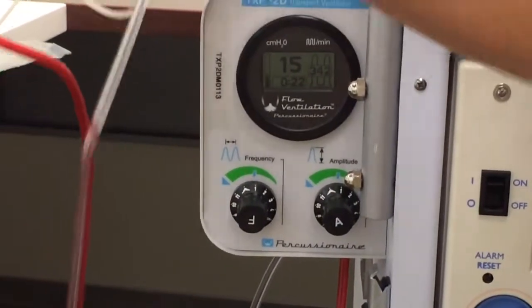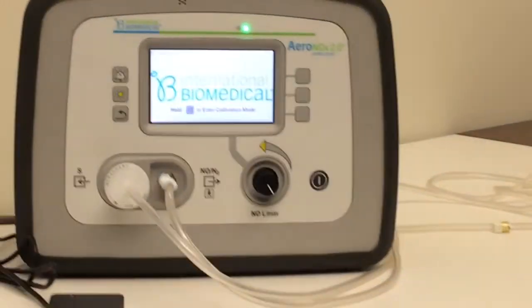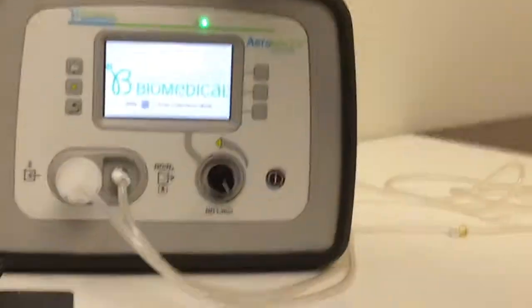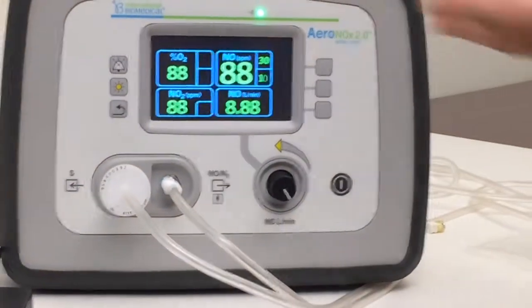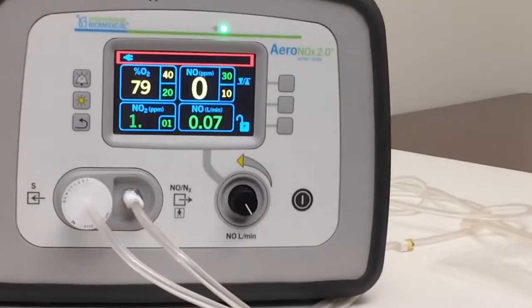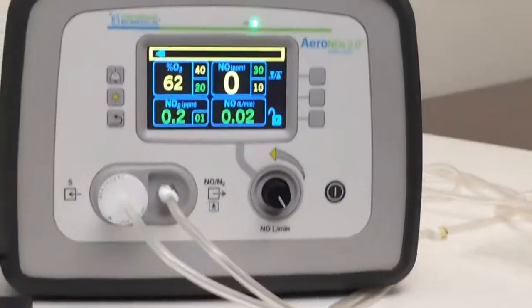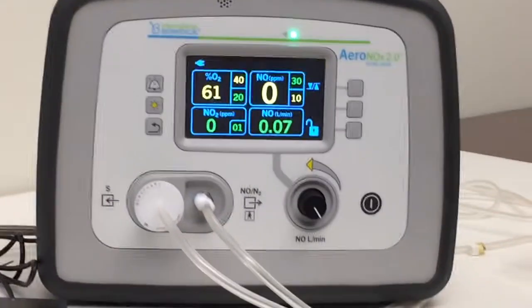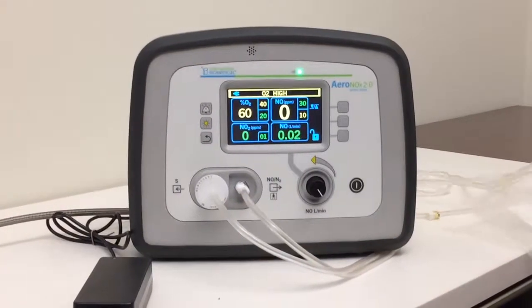So you've got gas flowing through the circuit, we're going to go ahead and turn our Aranox on. We're going to skip the splash screen — remember that was our calibration screen. So now we're running iNO through the machine, through the vent, and we should be getting a reading.